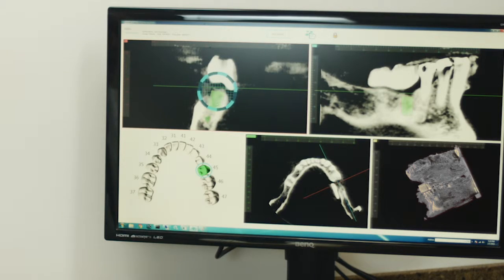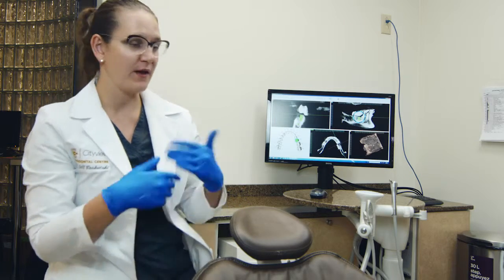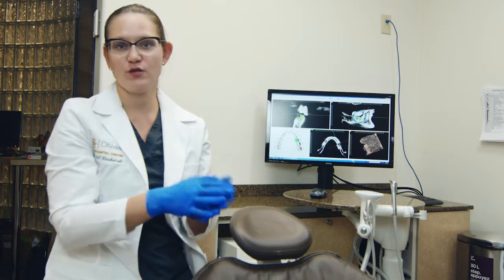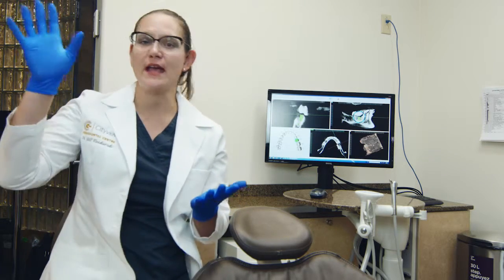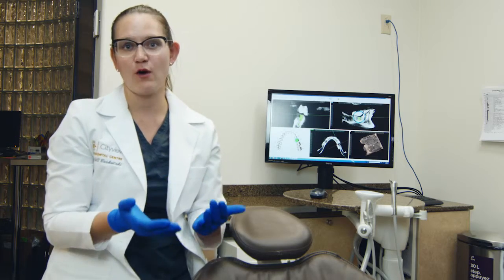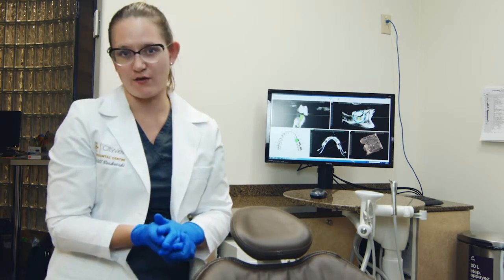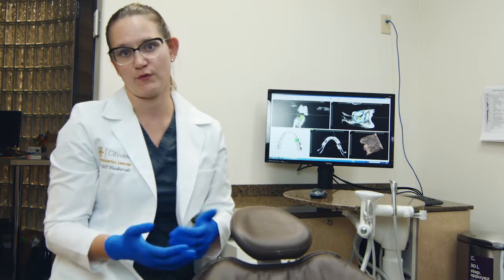I then brought the plan to the patient's mouth, where the patient would sit and I would apply the fiducial with the tracker and then use my handpiece with the tracker, and the system, including the camera lights above me, would allow me to actually execute the planned treatment, and I could see that on the monitors directly behind me in real time with three-dimensional viewing capabilities.